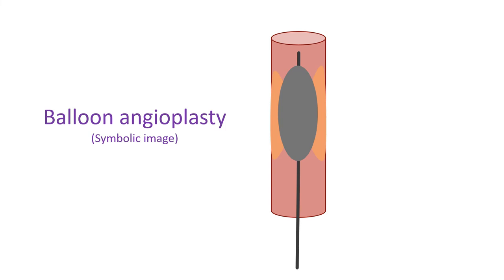Complications can also be due to contamination with room air, which contains nitrogen in plenty and can produce airlocks within the blood vessels. Use of a good airtight system and meticulous attention to technique can reduce the complications.